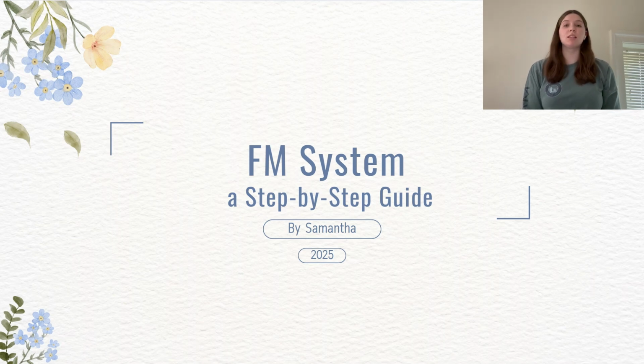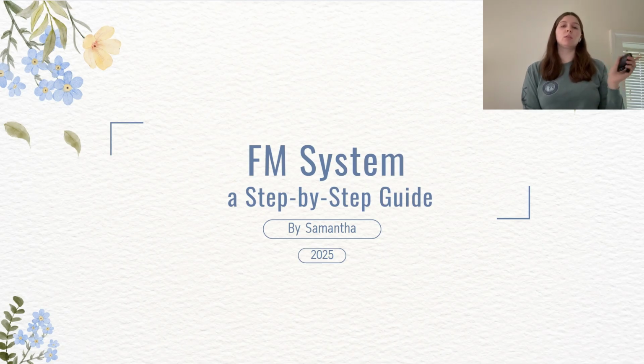My name is Sam, and I'm going to teach you how to use an FM system. The FM system that I have in my hand is the Roger touchscreen mic that is created by Phonak.